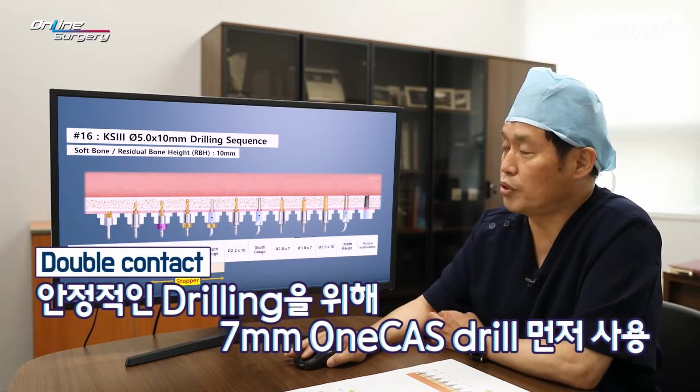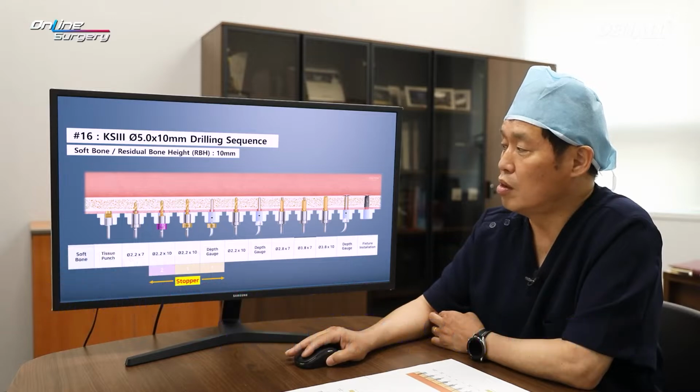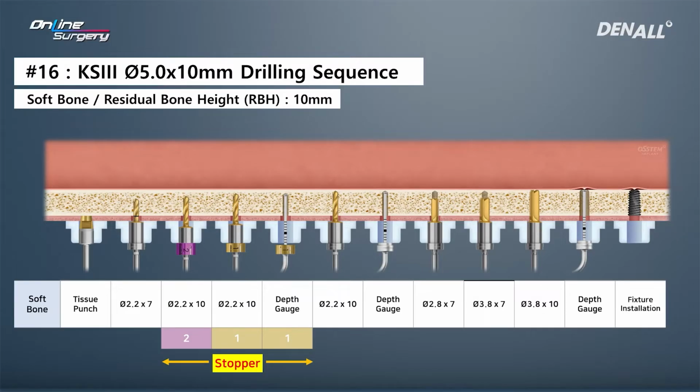You need to use the double contact concept for drilling in order to improve stability, and as shown, you need to use 2.8 and 3.8 by 7 millimeter drilling. After that, you can use the final drill 3.8 by 10 millimeter. With the depth gauge, check whether the sinus floor is penetrated and then place the implant.